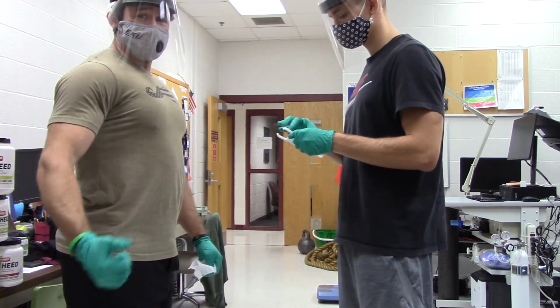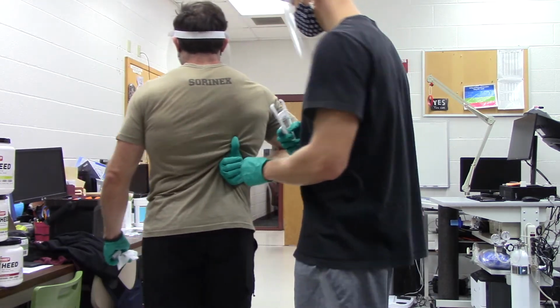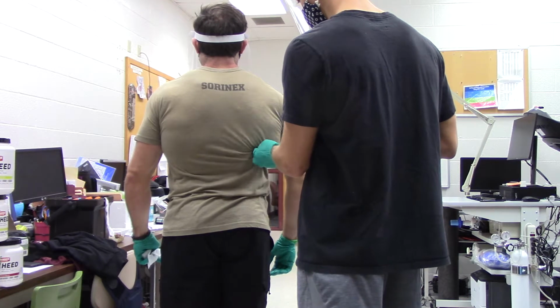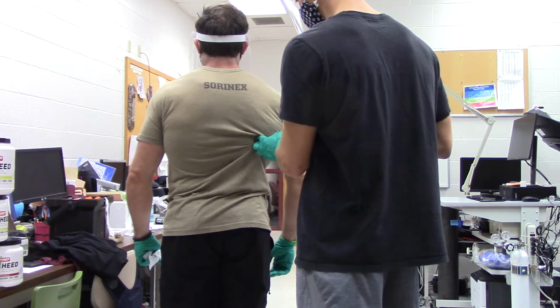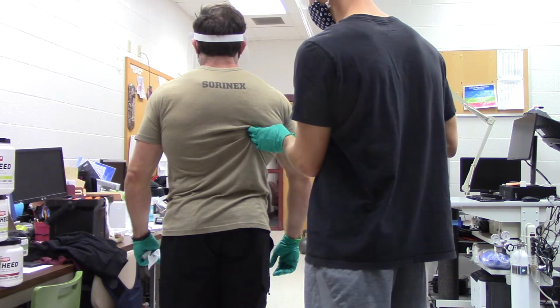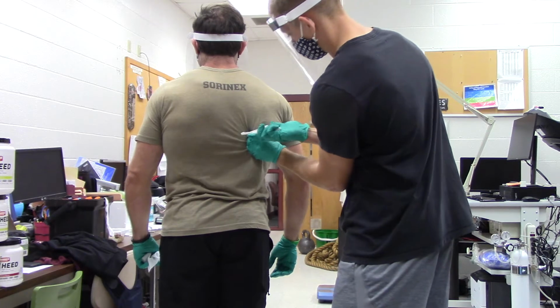The next measurement, when he's on the back side of the body, is going to be the scapula or subscapular. So he's going to find the diagonal point of the scapula. You need to go up and to the left a little bit. You'll feel that bone eventually. There's a lot of stuff on top of it. So he's going to grab on that diagonal both the skin and the t-shirt and take that measurement.